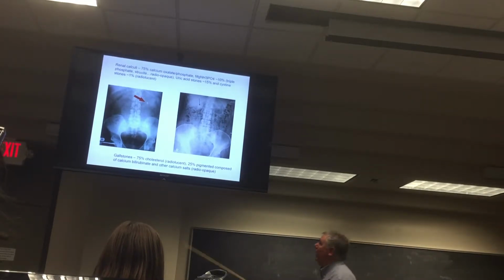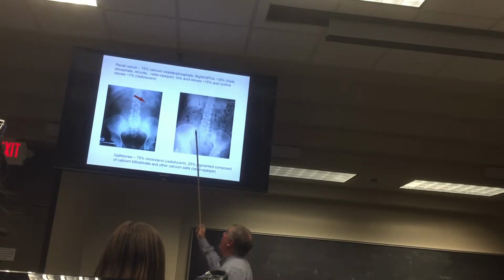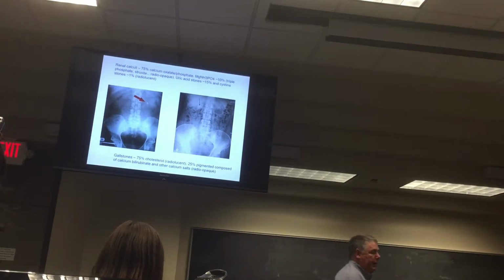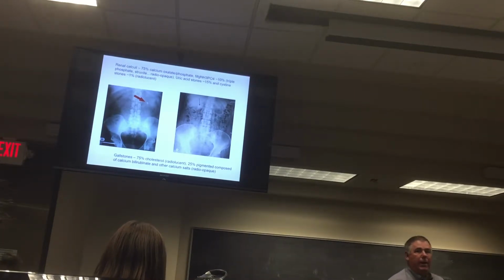There are gallbladder stones that do contain calcium salts and will show up as little circles, not solid balls like kidney stones do, but your chances are only 1 in 4. So if you suspect gallbladder, you're going to send them for another modality and not risk a 75% miss. Understand?